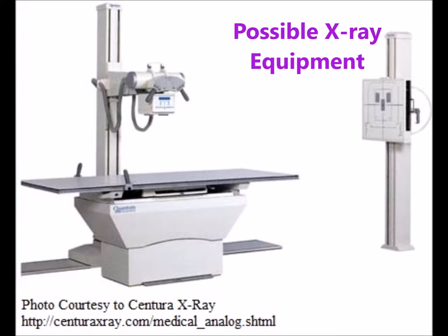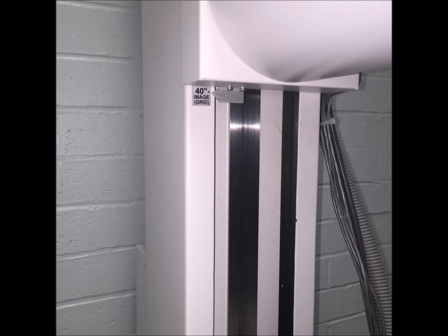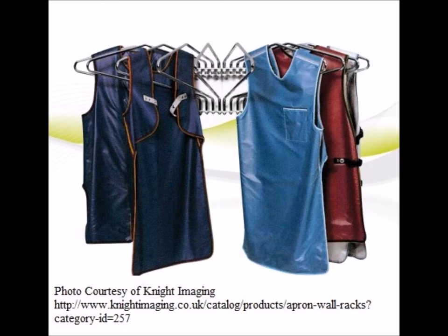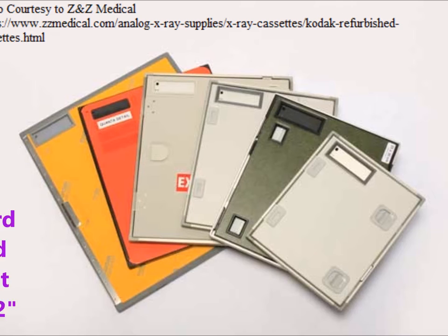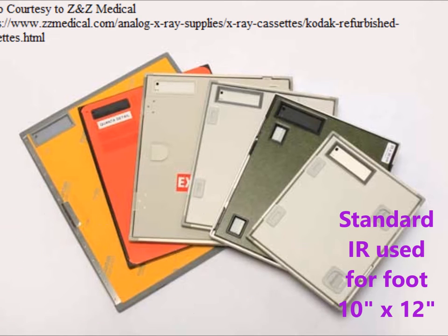This is your possible room setup for your x-ray. All x-rays will be taken at a 40 inch SID. You always want to make sure that you shield your patient. There are many cassette sizes, however for the foot we use the 10 by 12 cassette.